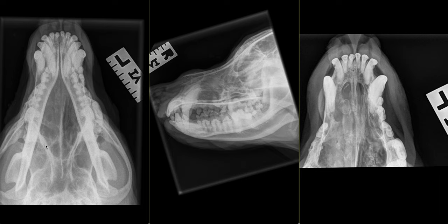The cribriform plate is well-defined and considered normal. Our conclusions for this patient are an aggressive mass lesion of the right nasal passage with lysis of the maxilla and nasal septum. There is additionally cortical expansion of the periapical spaces of teeth 104 and 107.